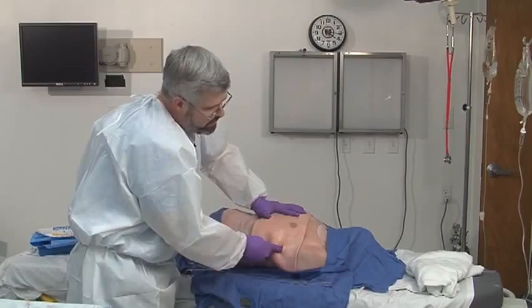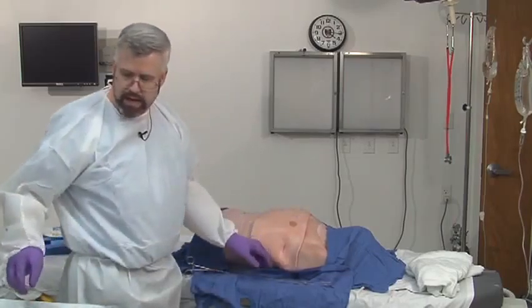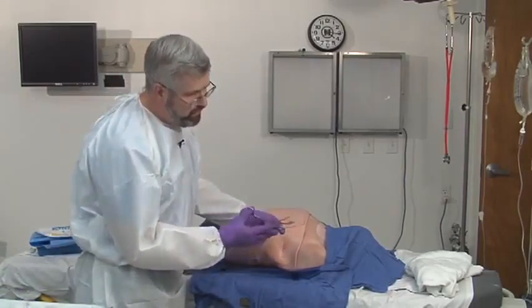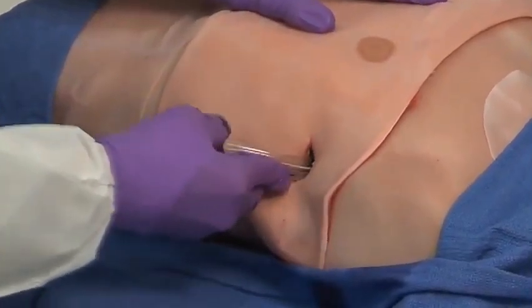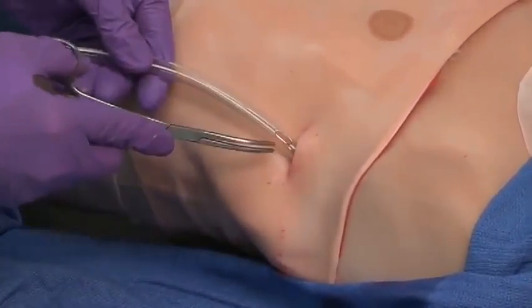Now the next step is to actually insert the chest tube. There are a couple of different ways of doing that. You can try to put the tube in directly, but I think many people find it convenient to take your clamp, put it on the end of the chest tube, and then follow this track right back into the chest the same way you went before. You can see I'm going into the chest. There's the last hole.